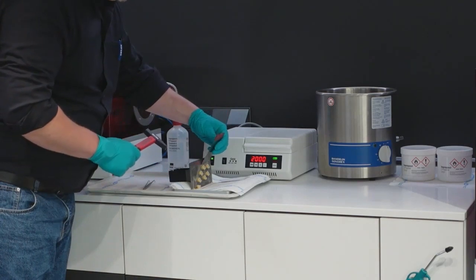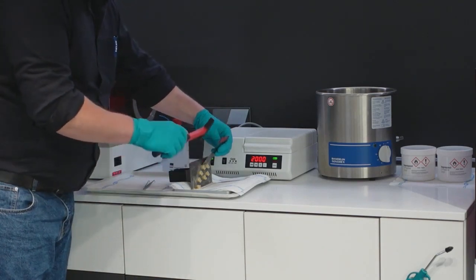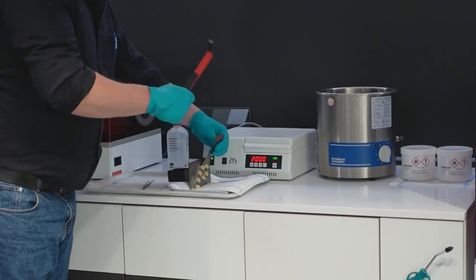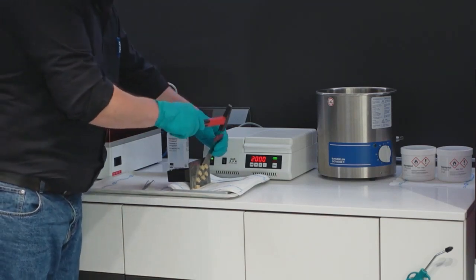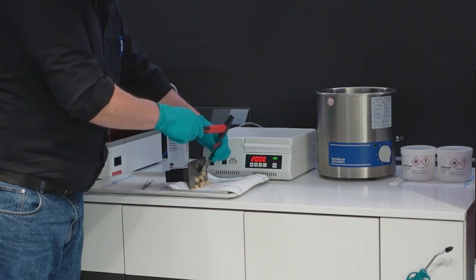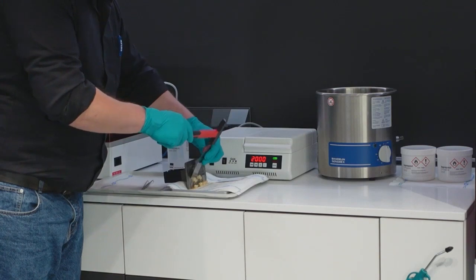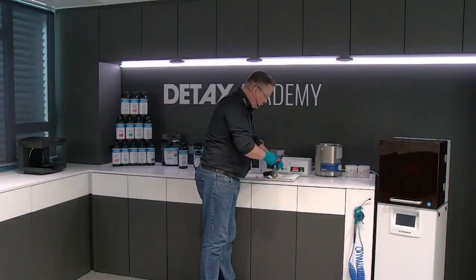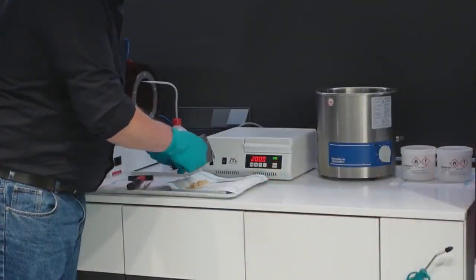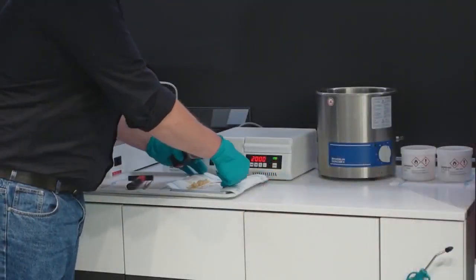So the easiest way is go about 45 degrees here, use a small hammer, and don't use it soft, let me say. You don't need so much power. It is only to knock a little bit on it, and it will fall down nearly by itself. That's the easiest way. Now we can control the platform, whether all cured parts are away from the platform.